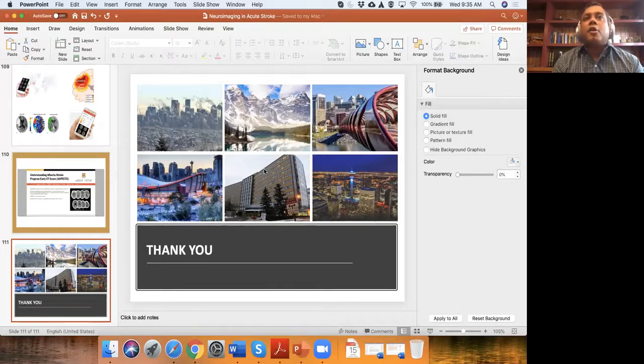So the extent of clot means that there is less likelihood of success with intravenous thrombolysis. And this is the clot burden score too. And then, as I mentioned, with thrombus characteristics like a permeable clot, you get a better sense that the clot might actually open up with thrombolysis. So you do need to look at your scans. You need to know whether it's a distal clot or a proximal clot. Proximal clot, consider endovascular thrombectomy. Huge proximal clot, you must think, oh, TPA may not be that helpful. Endovascular thrombectomy may be more helpful.